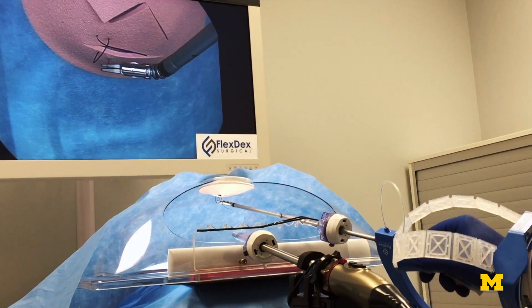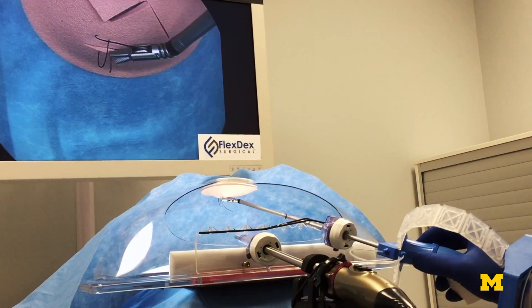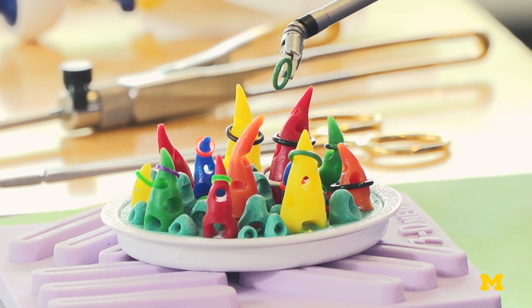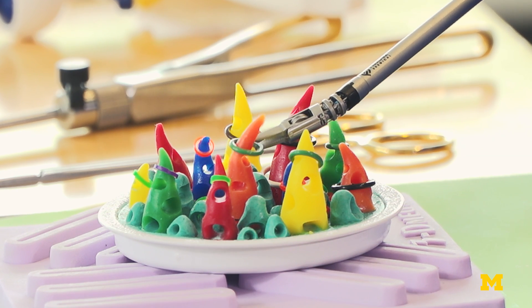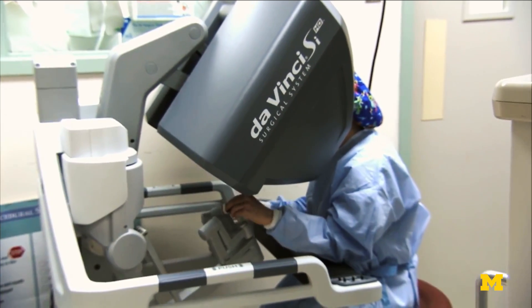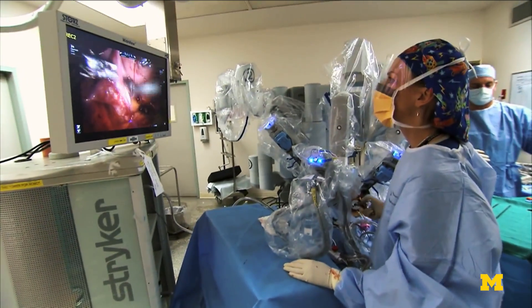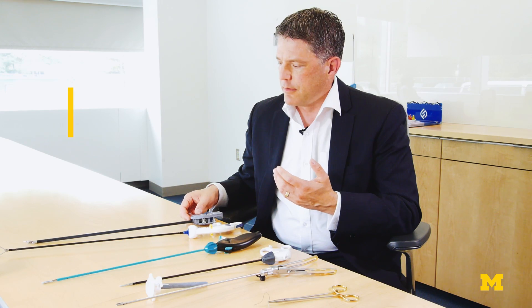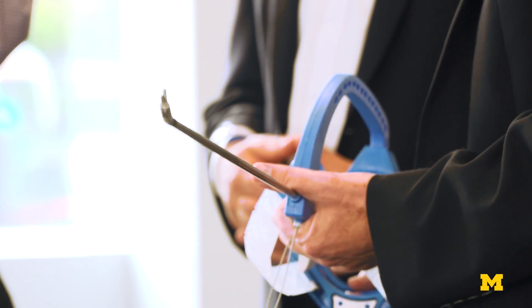This kind of innovation goes well beyond applications just in surgery. This is an example of a remote control device done purely mechanically, without the use of any robots, sensors, actuators, or computers. In 1999, the surgical robot called DaVinci came to market, and it does move like the surgeon's wrist — but it takes a $2.5 million robot on the back end to drive it. We deliver the same intuitive control that the robot does, but without the robot, bringing robotic-like functionality to every OR, every day, any hour of the day.